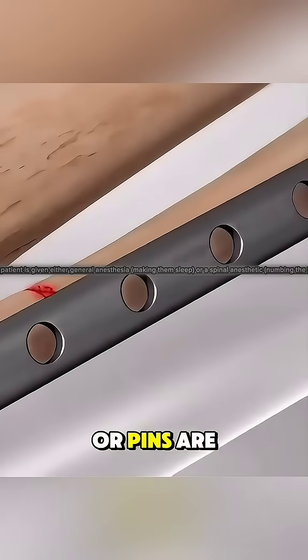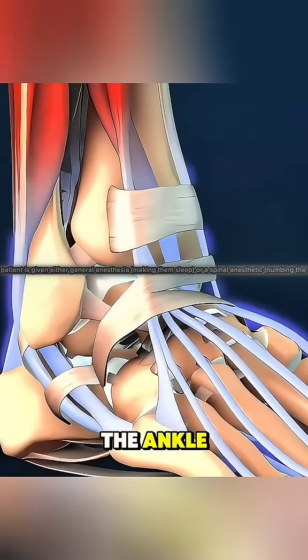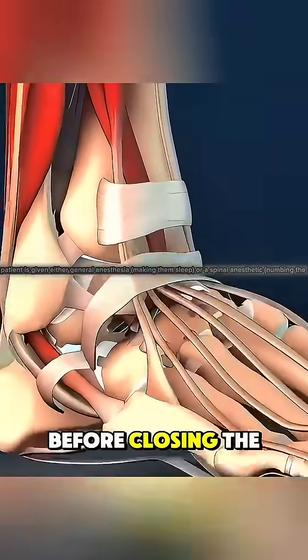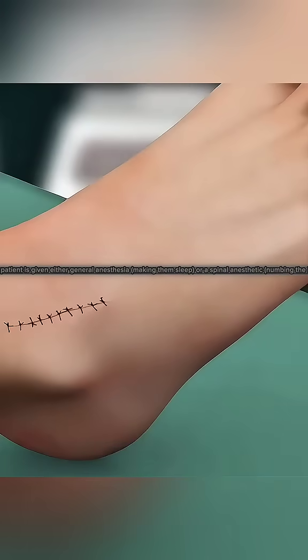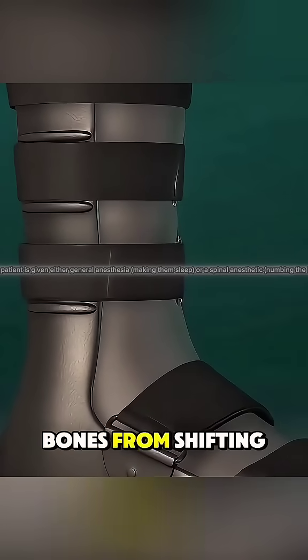Sometimes, small wires or pins are also used, depending on the fracture pattern. The surgeon checks the alignment and stability of the ankle by gently moving it before closing the incision with sutures or staples. A splint or cast is applied to protect the repair and keep the bones from shifting.